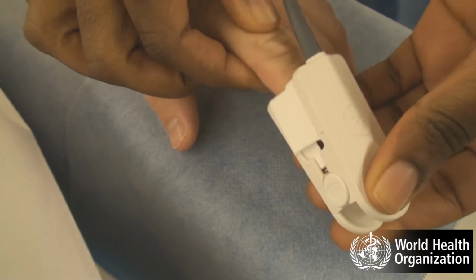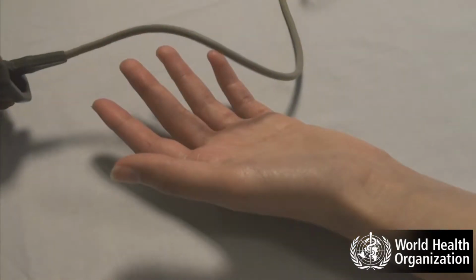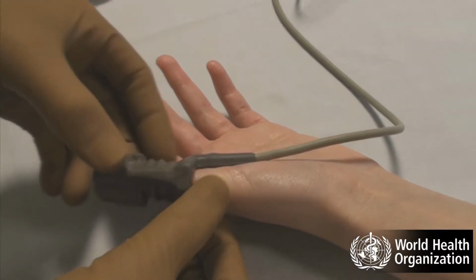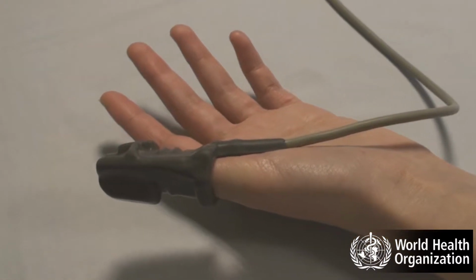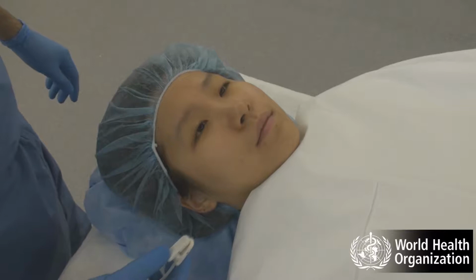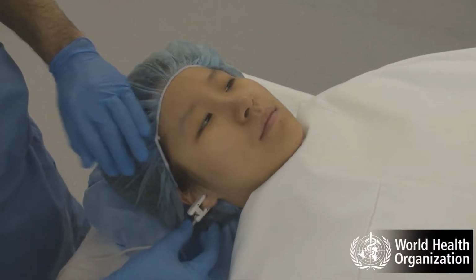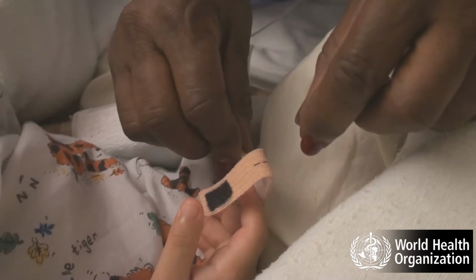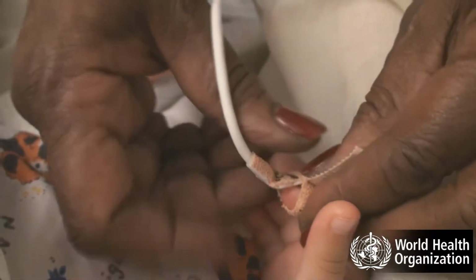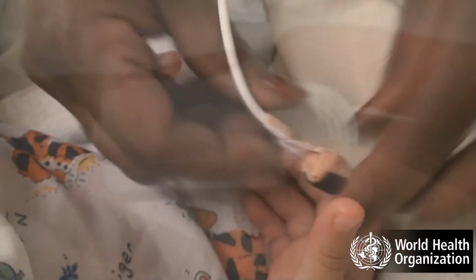Hinged probes are the most popular, but are easily damaged. Rubber probes are the most robust. However, the wraparound design may constrict the blood flow through the finger if it is too tight. Ear probes are lightweight and are useful in children or patients with constriction of blood vessels. Smaller probes have been designed for children, but an adult hinged probe may be used on the thumb or big toe of a child.